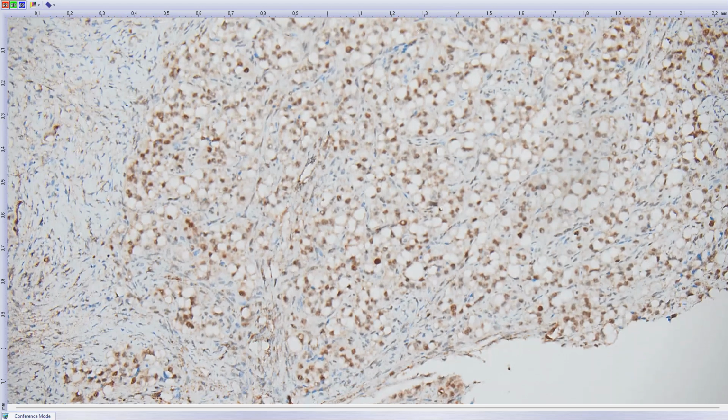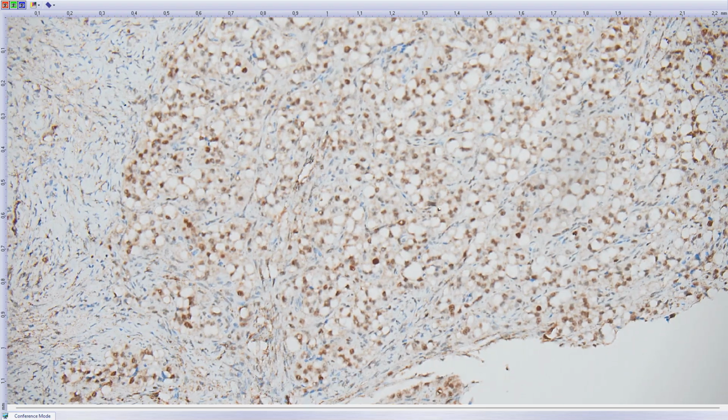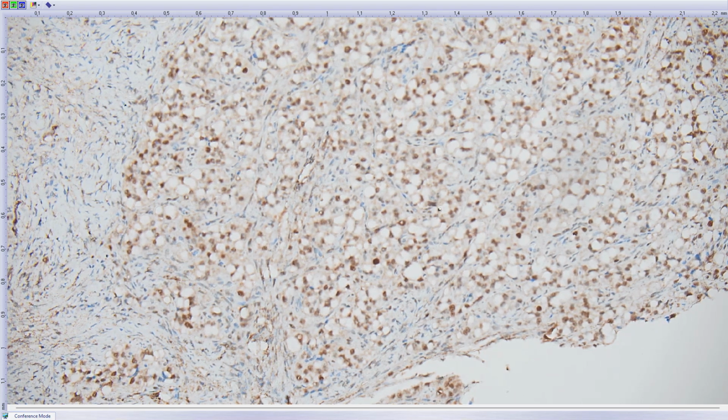SF1 positivity, which clearly shows that this positivity is not specific for any Sertoli cell tumor, so that we think that this case is another example of signet ring cell change of solid pseudopapillary cystic tumor of pancreas. With all these tumors in testes and in ovary, so far described, behaved in a benign way.